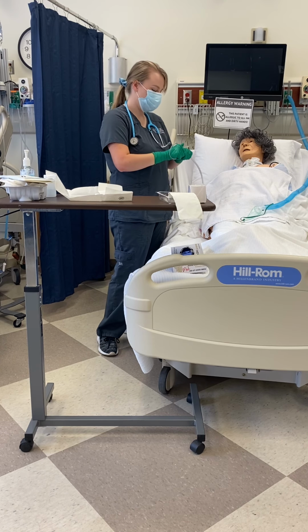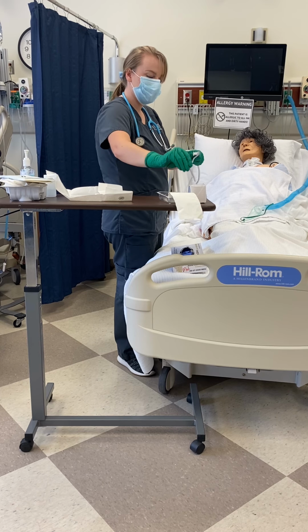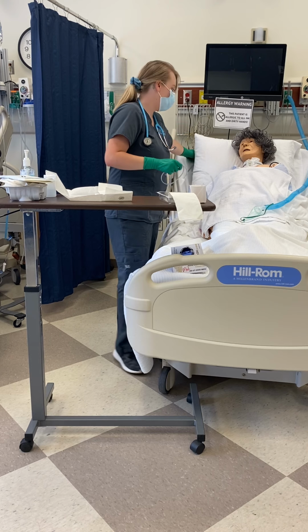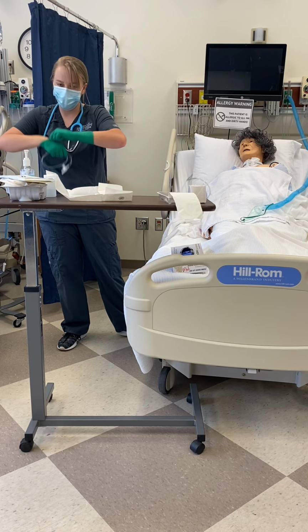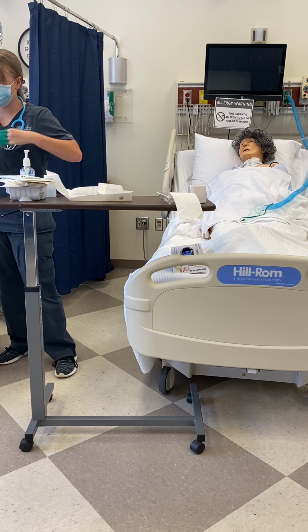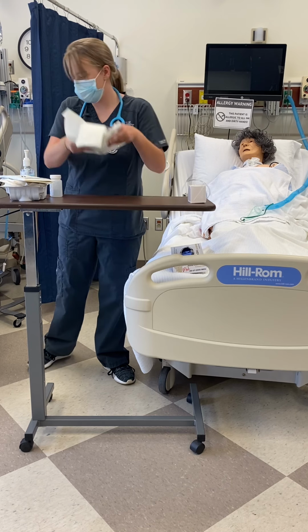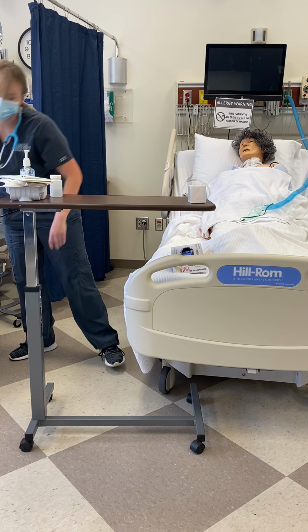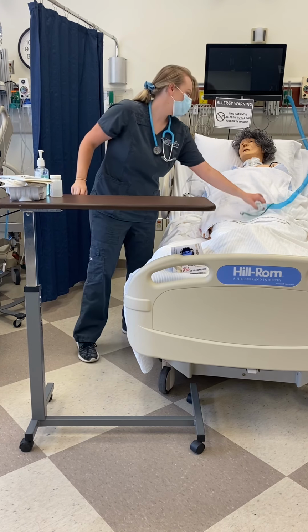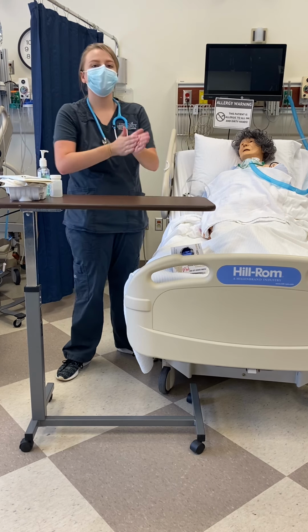And then I will also suction more to make sure this is all cleaned out. And once I'm done with that, put this back on my patient while I'm getting everything ready. Hand hygiene.